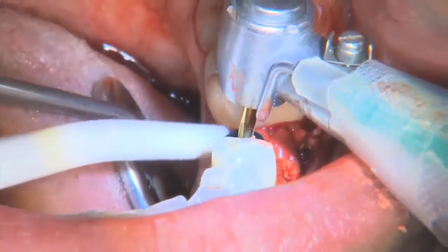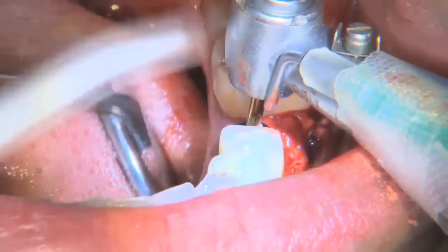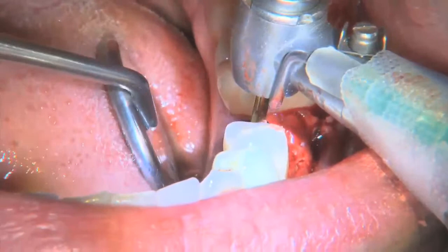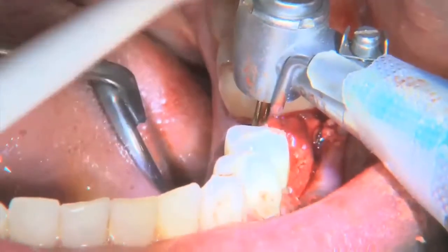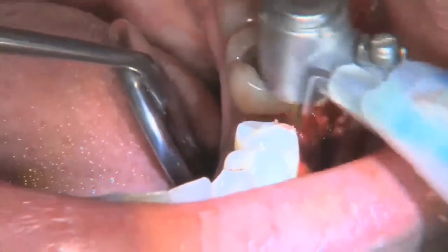Sometimes, with the presence of blood and over-tightening the abutment, it can become severely locked into the implant and create some great anxiety when you're trying to remove it at a later date.